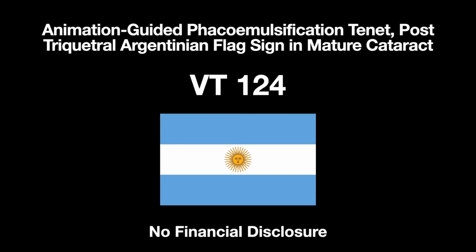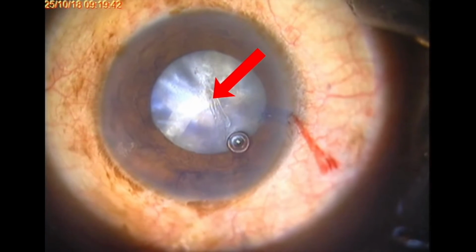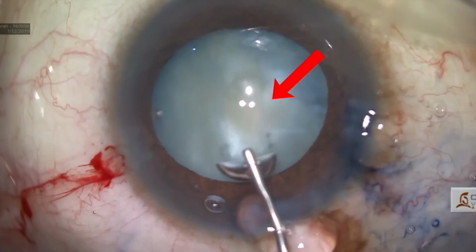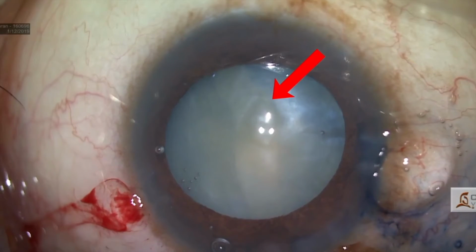The surgical tenet of Argentinian flag sign in an intumescent mature cataract. The Argentinian flag sign typically arises after an initial puncture of the anterior capsule, following which self-propagating tears radialize rapidly in two opposing directions to the periphery of the anterior capsule in an undesired and uncontrolled fashion.